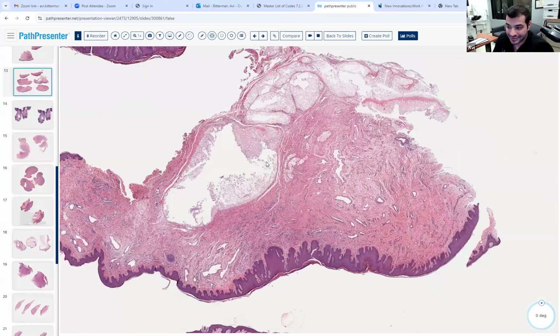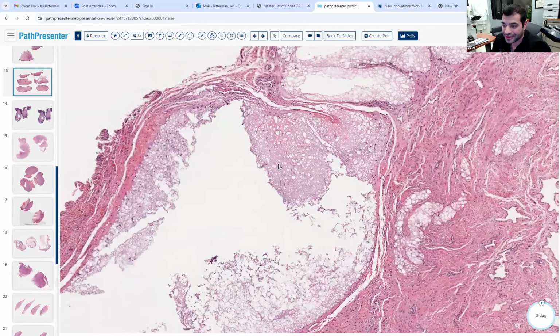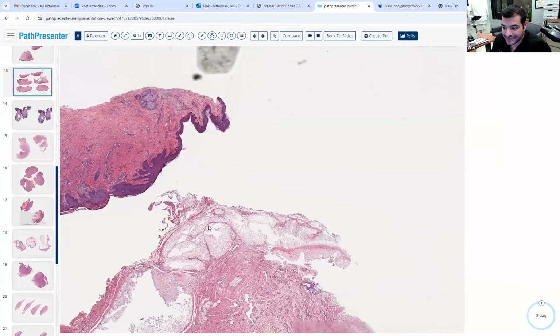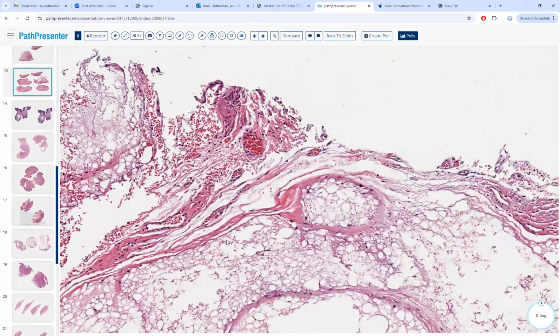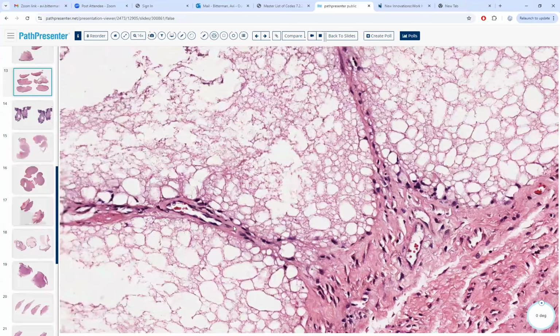What happened here? Necrosis of the fat? Okay, you can think of necrosis of the fat. What's wrong with necrosis of the fat? Well, let's see. There are no discrete fat lobules. There's really no fat here. And it's frothy.